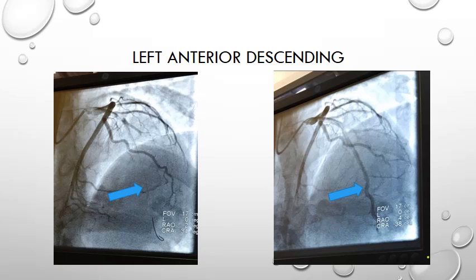And here we have pictures of the patient's angio from the cath lab, also courtesy of Alex Beckett. You can see the one on the left with the catheter in the blocked left anterior descending, and the one on the right showing the artery now open.